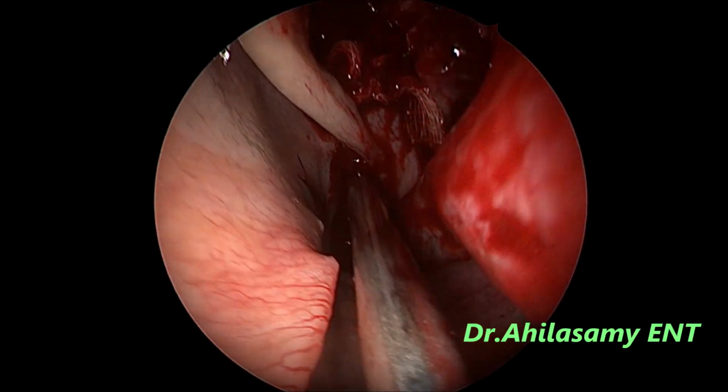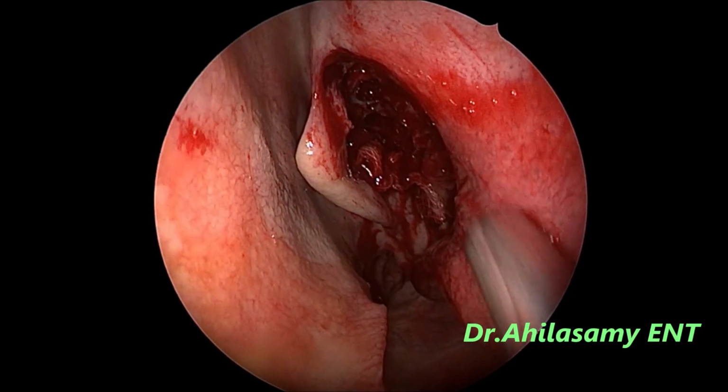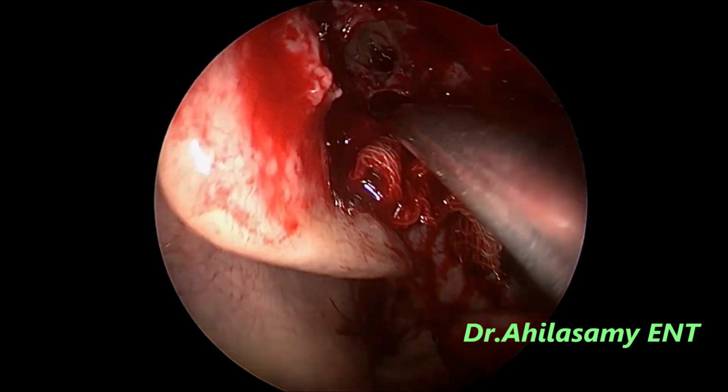This patient is very comfortable, and you can see they appreciate the field quality. Maxillary sinus in this case is also okay and beautiful.